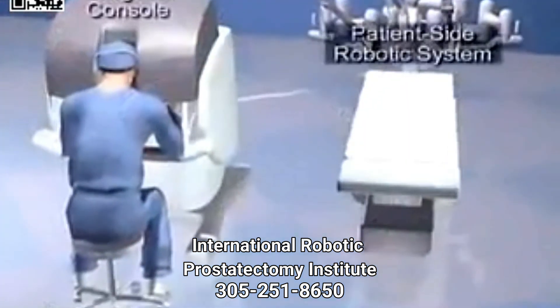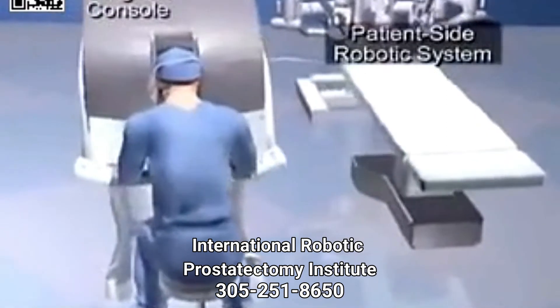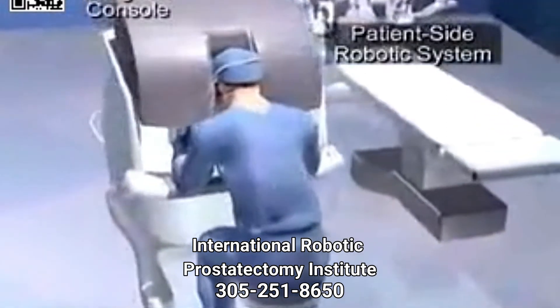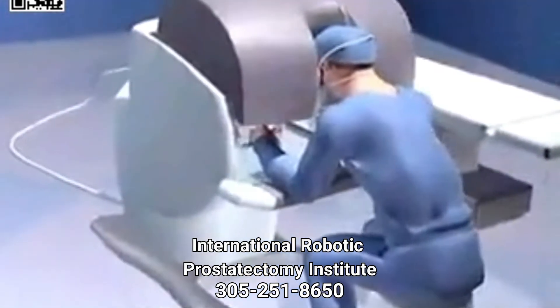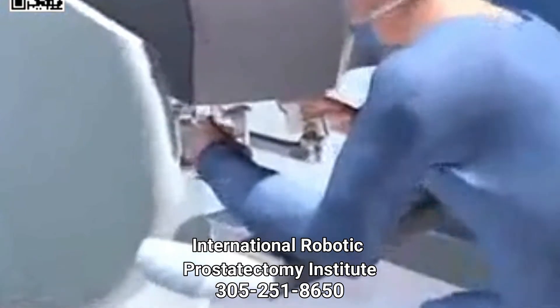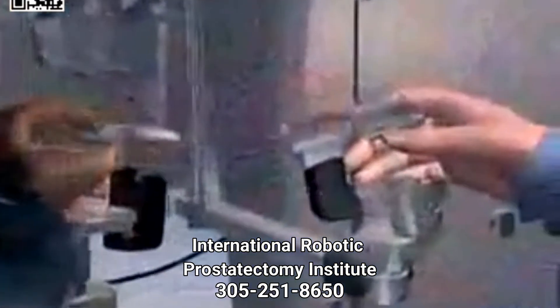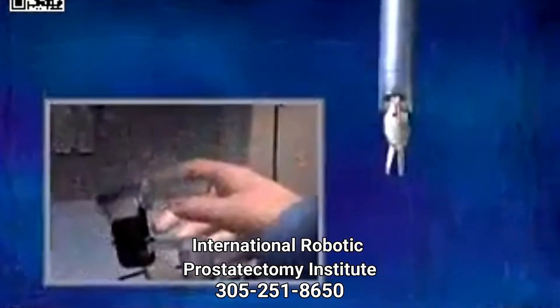The da Vinci Surgical System is a state-of-the-art medical device comprised of a surgeon console and a patient-side robotic system with a high-resolution camera and micro-instruments used in surgery. The computer-enhanced system scales the hand movements of the surgeon at the console down to micro-movements of the surgical instruments on the patient-side system.